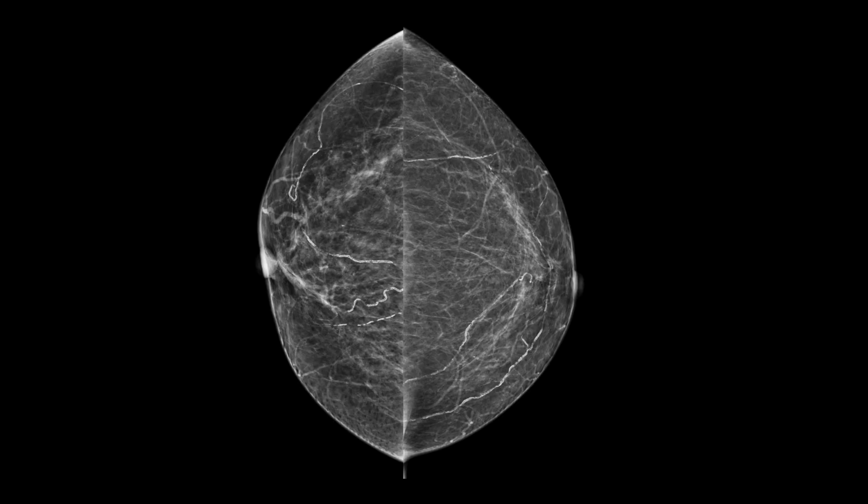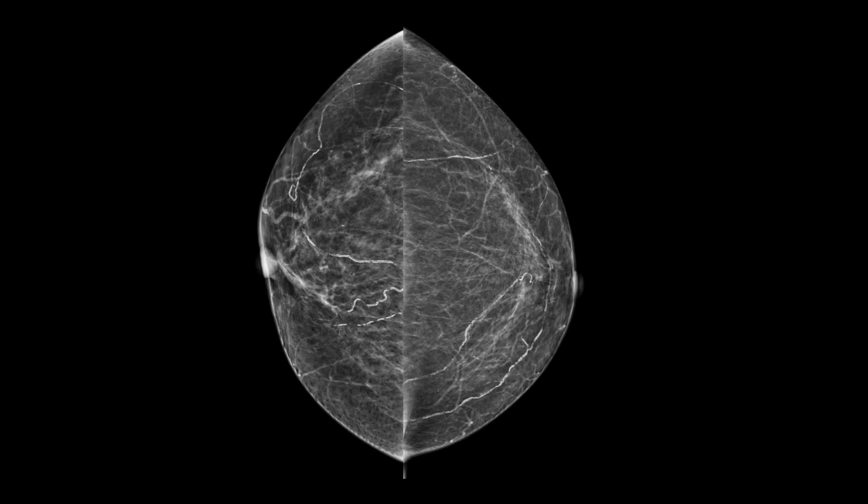This is an example of a patient who is on dialysis. This is why you see all those calcifications, and this is why you see that the craniocaudal view is not the best, because she has all of the dialysis on the right side. The patient was booked to have a renal transplant, and her dialysis was booked within less than 24 hours of the exam. Therefore, we can give her the IV contrast.